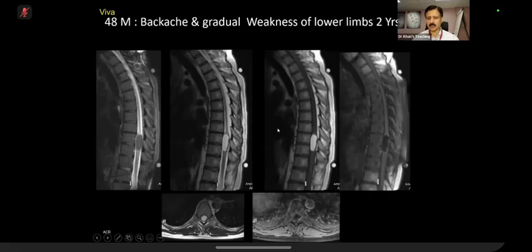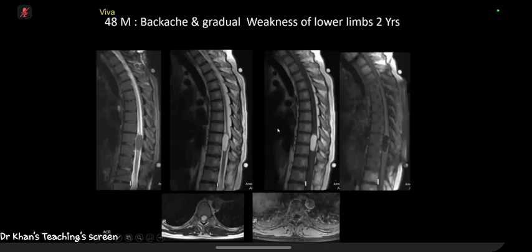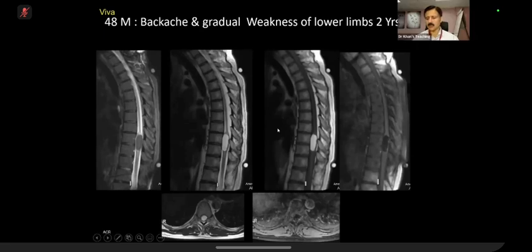Having said that, how do you discriminate, radiologically speaking, between a lipoma and a dermoid? And this is a key question for the Viva. I think this would be extremely atypical. Where I've heard about it is lipoma of the filum terminale. So it's at the end. So please remember, if you read your Chapman, it tells you that lipomas can also be intramedullary, by the way.